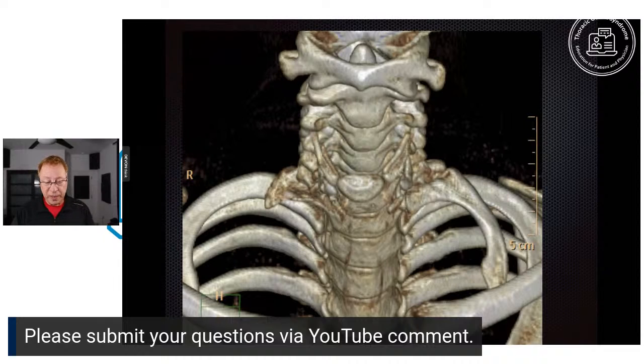You can do things with CAT scan like make three-dimensional images. This one has a big cervical rib on your right side, the patient's left. And for many surgeons, seeing in 3D is much easier. Radiologists do this all the time. Surgeons don't. So when we can make 3D models like this, it helps out a lot of people.